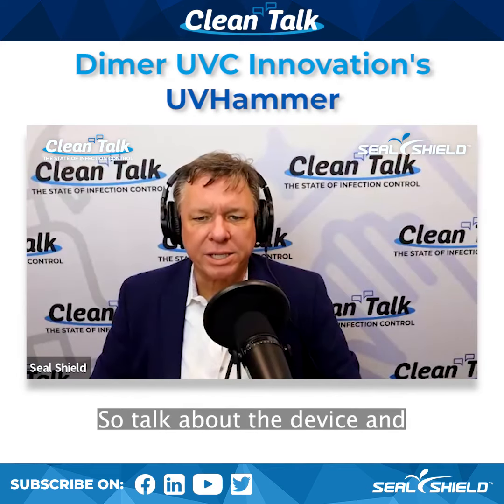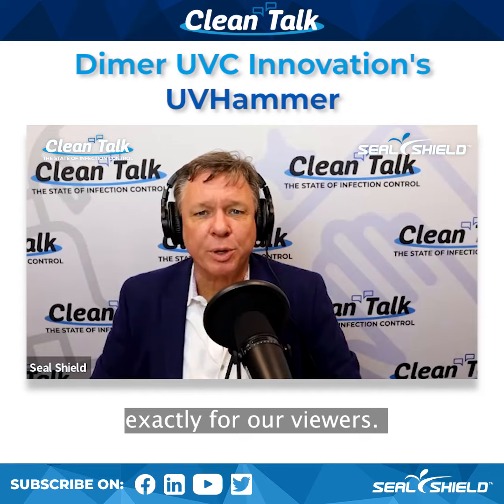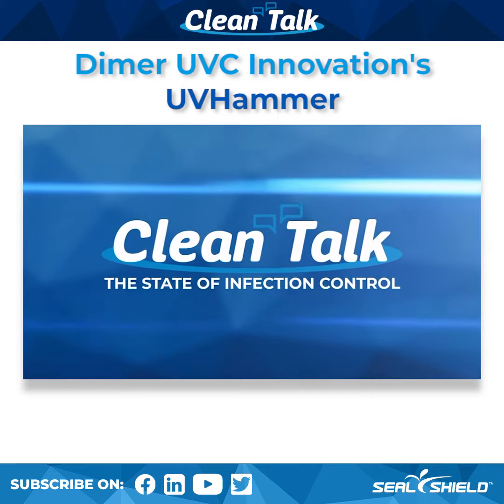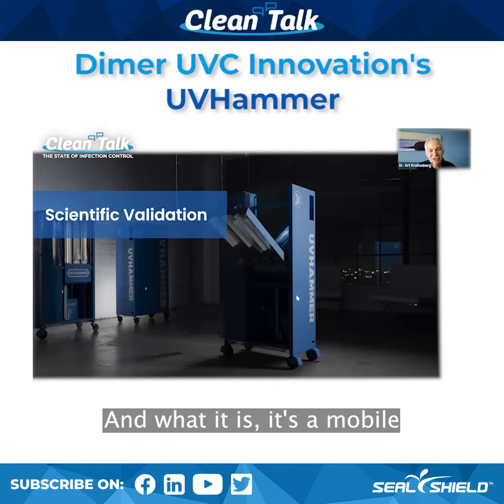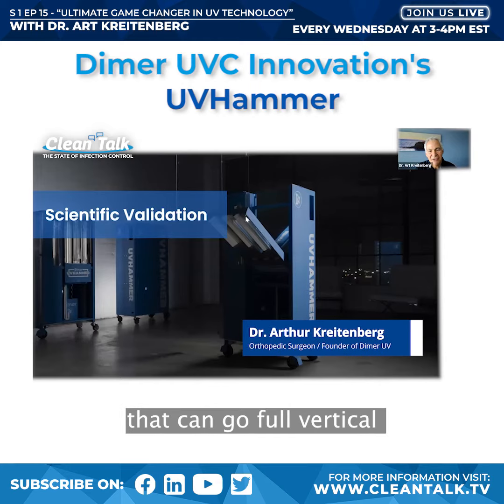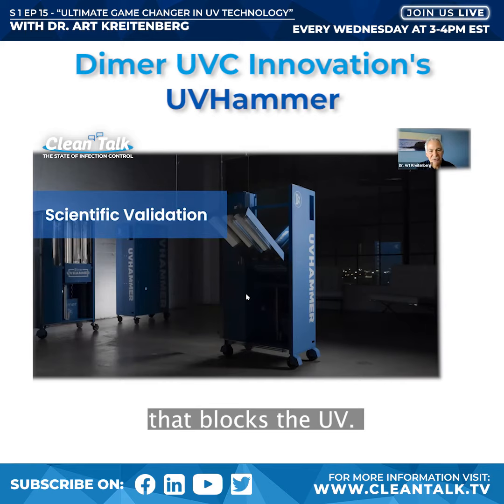The UV Hammer looks like this. It's a mobile platform with a wing that can go from full vertical to full horizontal. It's pushed around by an operator behind a patented shield that blocks the UV, so there's zero operator exposure — third-party tested.